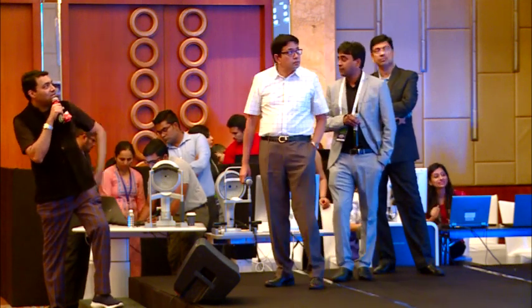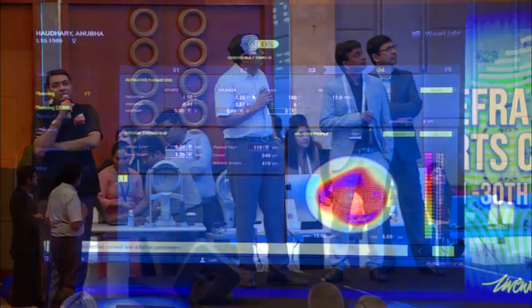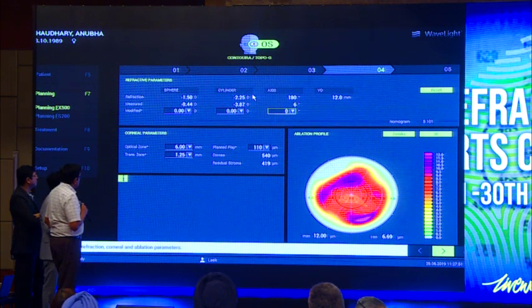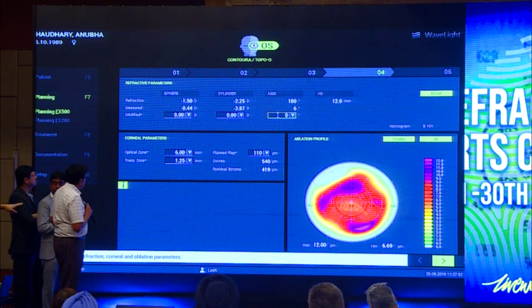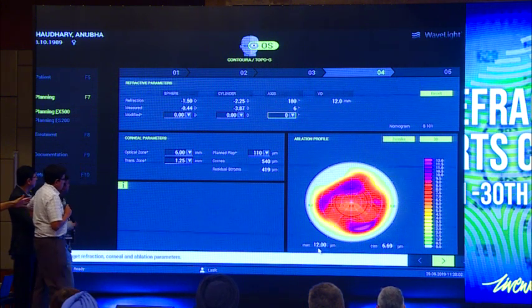And in this case, sir, now again, it's a second group. The second group has 1.5 diopters of change. The patient acceptance is 2.25. What the machine measured is 3.87. The axis is bang on now. It's only 5 degrees change. So now if you go back to that with-the-rule, you have a huge amount of aberration.